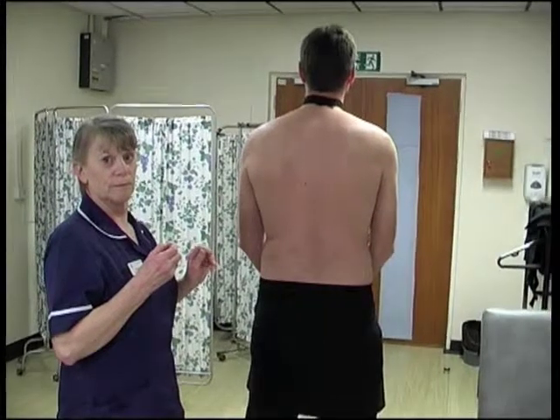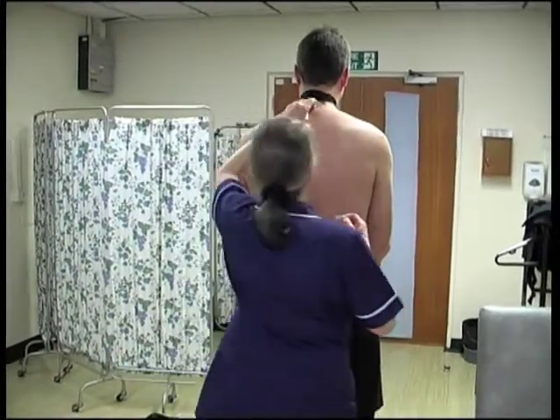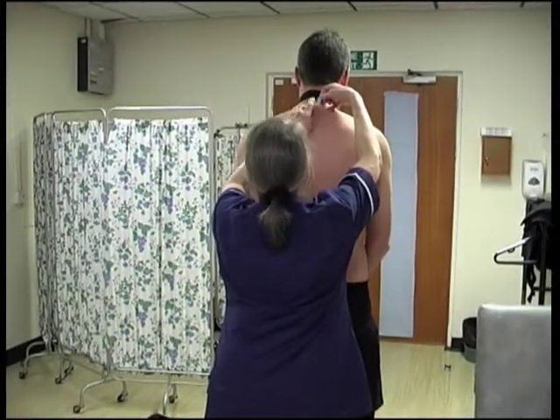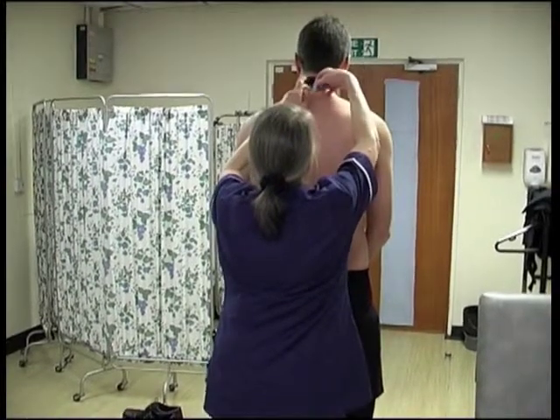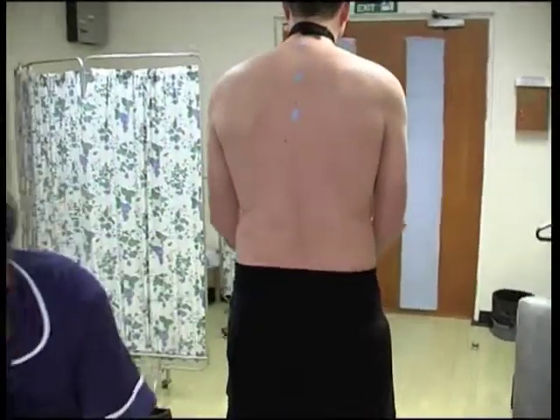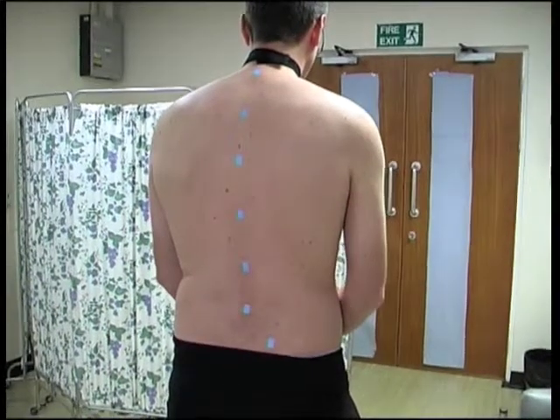To identify some body landmarks, we put some stickers on your back. We'll ask you if you have any skin allergies — for example, does your skin react badly to elastoplast? We put one sticker at the top of your back, some down the spine, and two at the bottom of your back.